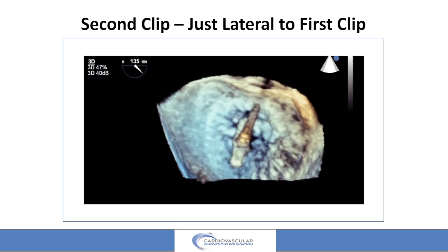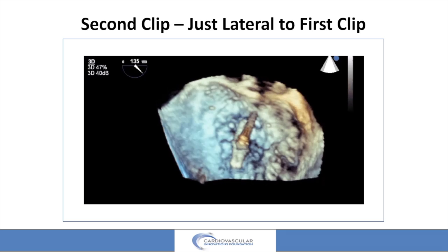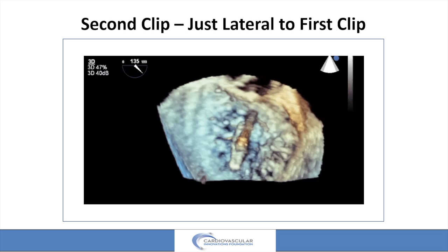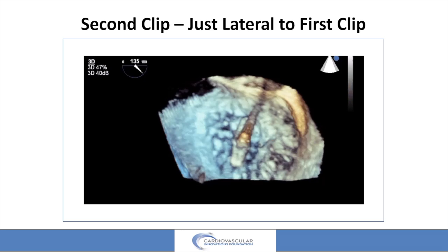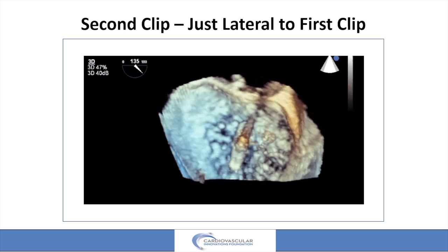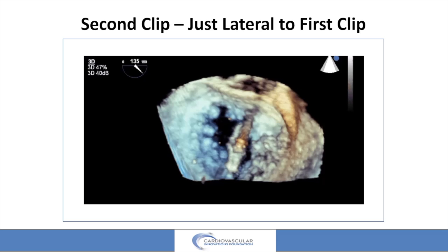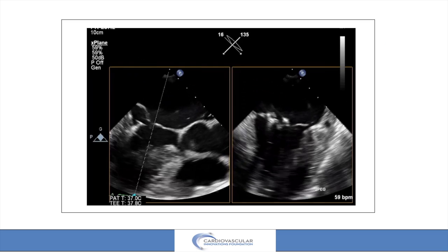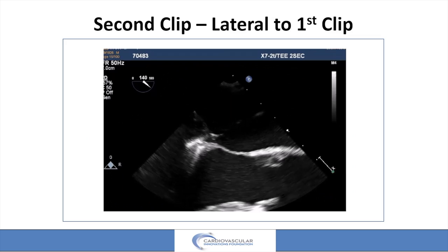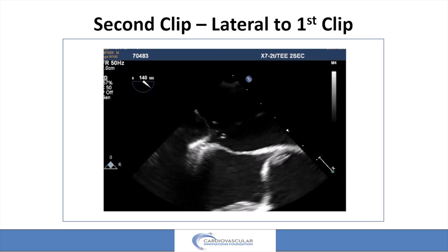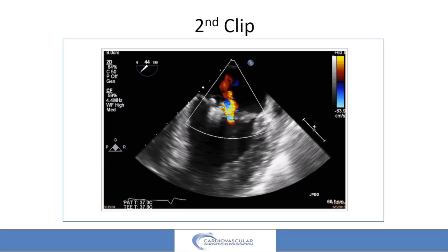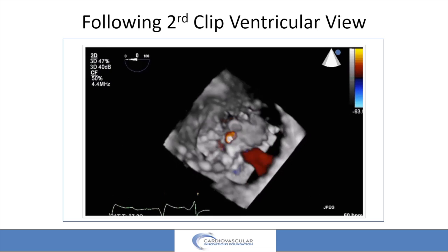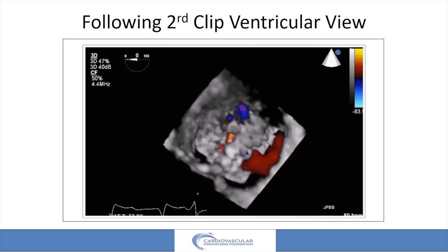Here comes the second clip, just lateral to the first clip — we're going to get it very close to it. When I'm putting a clip lateral to a more medial clip, I'm not holding respirations and I try and get real close to it. Once I'm underneath it and ready to grasp, I'll go off respirations — it'll bring it more medially and I'll be right up against that other clip. We work on the second clip, get a grasp, and it's nicely engaged. With that, we've got just a small leak just lateral to the second clip, nothing medial. You can see the bigger PISA just lateral to the second clip, which is what we're going to treat.